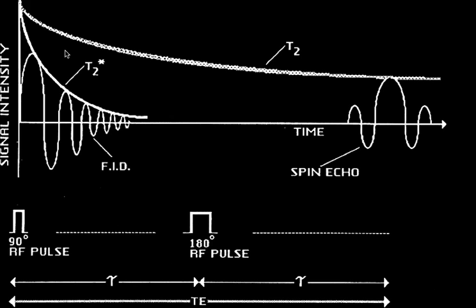Okay. The T2 star here is due to the 90-degree pulse. When you do a 180-degree pulse, we're just flipping the spins 180 degrees. You're not forcing the spins into the XY plane, you're just flipping the bulk magnetization vector upside down. If time t equals 0, let's say we have an inversion recovery sequence, which we talked about before. If we put the body in the magnet and then give a 180-degree pulse, you flip the bulk magnetization vector from z to negative z, but you get no XY component, and therefore no signal and no T2 star.